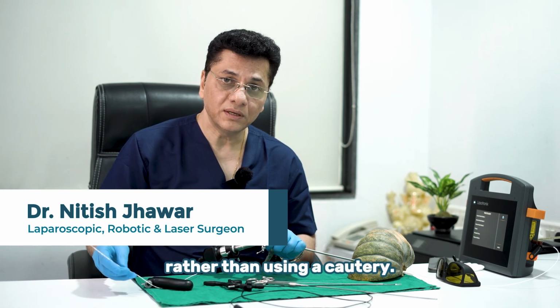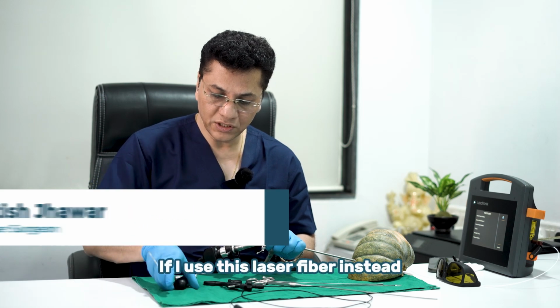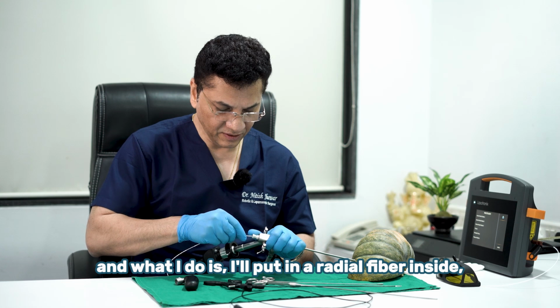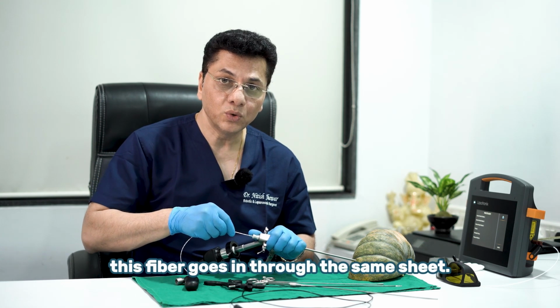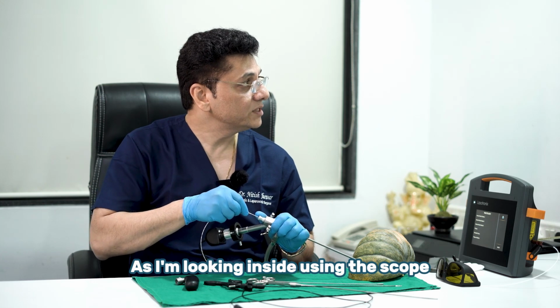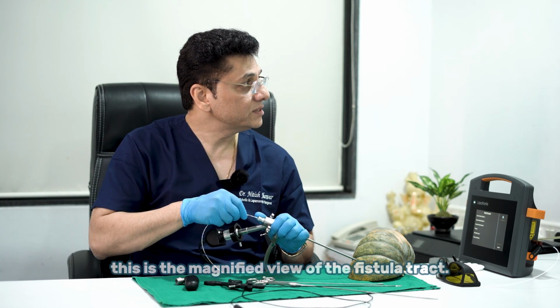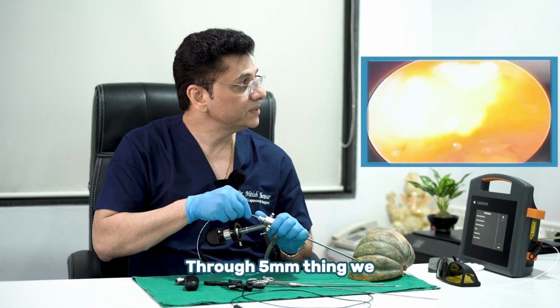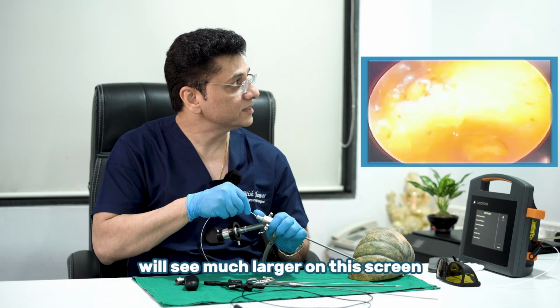Rather than using a cautery, if I use this laser fiber instead, then what I do is put a radial fiber inside. This fiber goes in through the same sheath as I am looking inside using the scope. And mind you, this is the magnified view of the fistulous tract. The 5 mm thing will seem much larger on this screen.